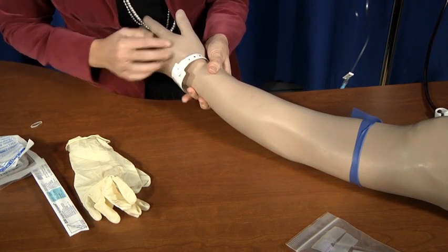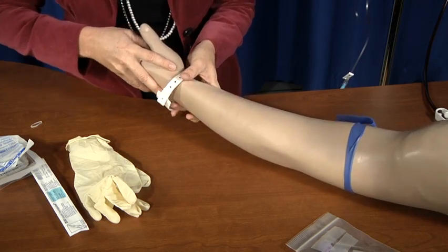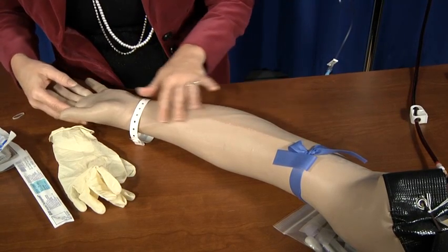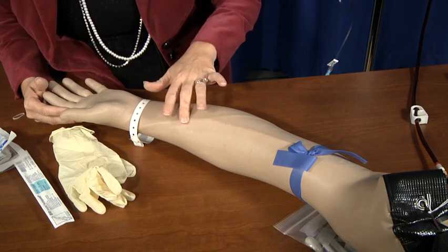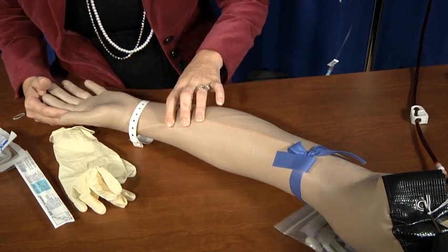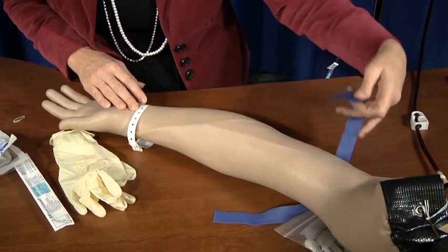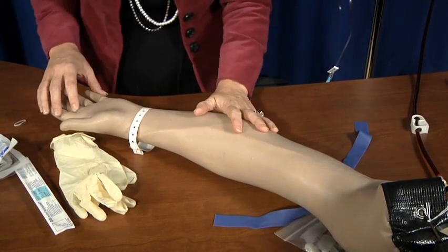We do not typically choose the hand because it's rather painful. So for this IV initiation, we're going to use this nice long vein here. There's no valves that you can see, no lumps. It's not hard. It's very soft and pliable. There's no swelling. So this is a good choice. We've made our choice. We don't need to keep our tourniquet on for any more than 2 minutes, so we're going to take that off.